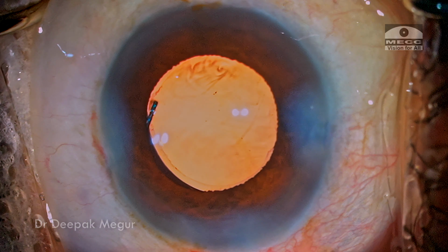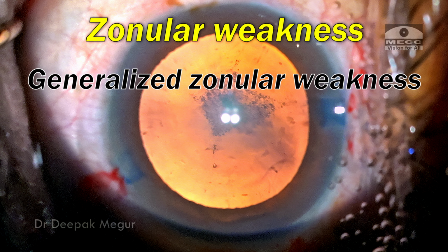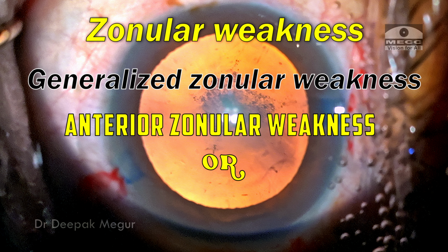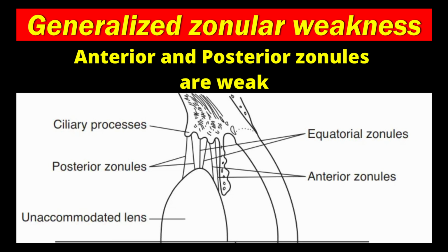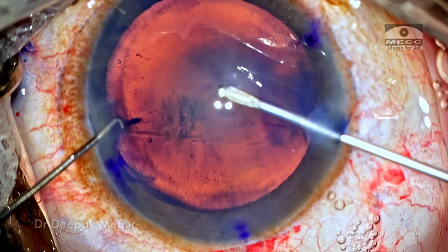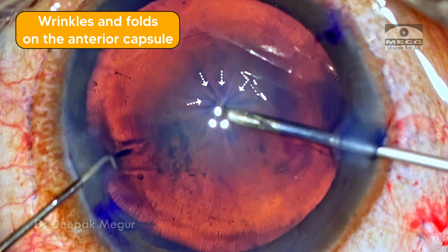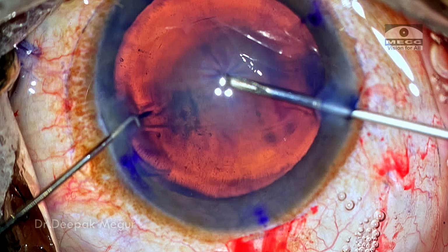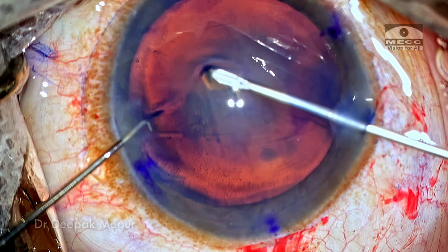So let me go back from the beginning in this case. As we all know, zonular weakness can be generalized zonular weakness, or could be specific to just the anterior zonular weakness, or could be just the posterior zonular weakness. More common is the generalized zonular weakness, where the entire zonular apparatus, both the anterior and the posterior, is weak. The evidence of anterior zonular weakness would be whenever we puncture the anterior capsule, we see these radiating folds coming across the puncture point, and these are indicative of the anterior zonular weakness. And whenever we want to tear the capsule, tearing is going to be much more difficult.